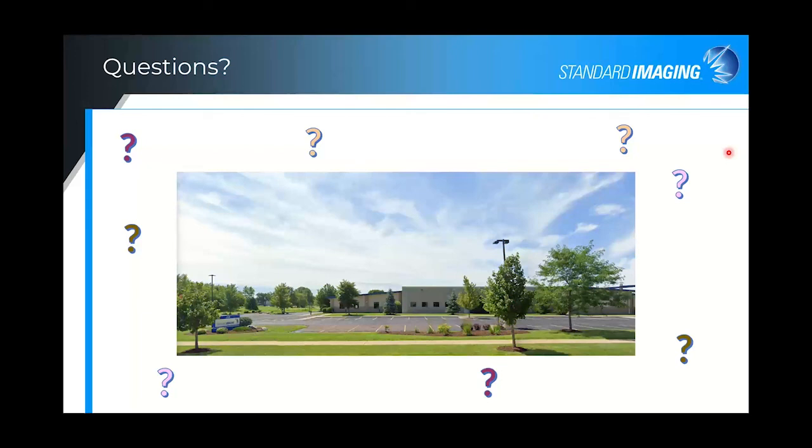Let's see what other questions we have. I think I've answered what are the possible errors. What will be the gantry angle at 0 degrees? I mean, the gantry angle is at whatever position the plan specifies.